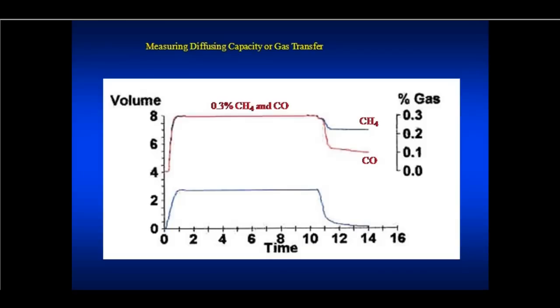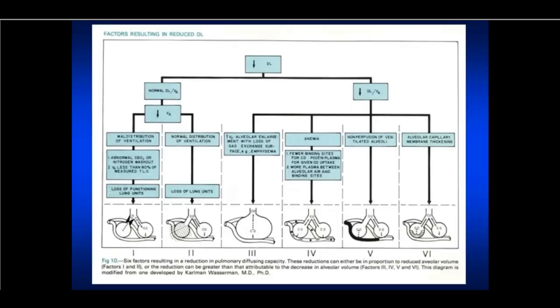Now, you could have a person with bad COPD and they have huge time constants, and during that 10-second breath hold, the distribution of gas was in a very small space, even though their lungs are huge. It just never got to that bolus. It just never got to that poorly aerated part of the lung. And that's important information to know, too. We'll see an example of that momentarily.